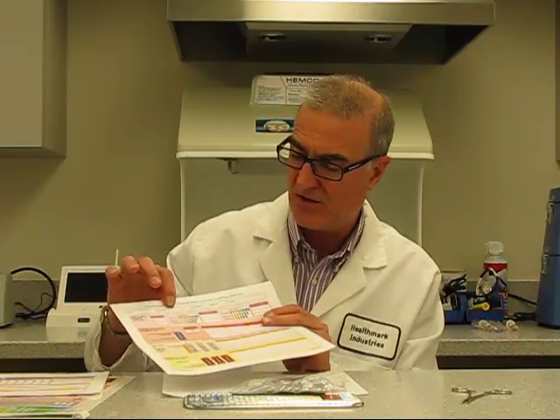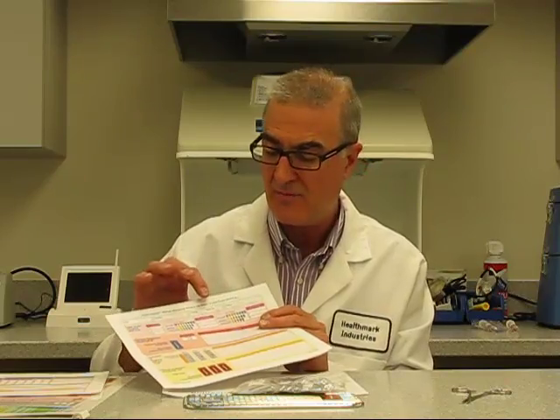The other thing you'll see on our checklist that is very important, you would put your day, your facility, the washer if it has a number, and the rack and who's doing it. And the rack is very important because racks themselves are individual. They're metal, they bend, they move a little, so each rack could be different. Each spray arm moves differently. There could be a cracked bushing.